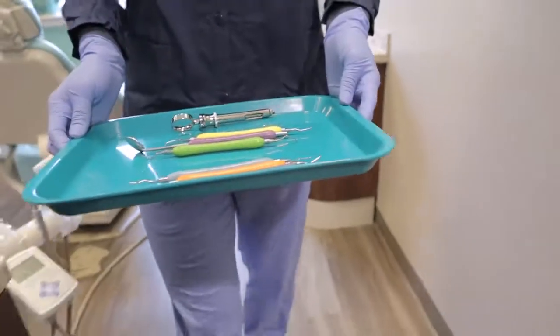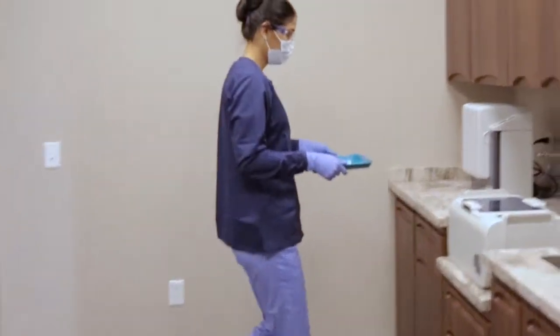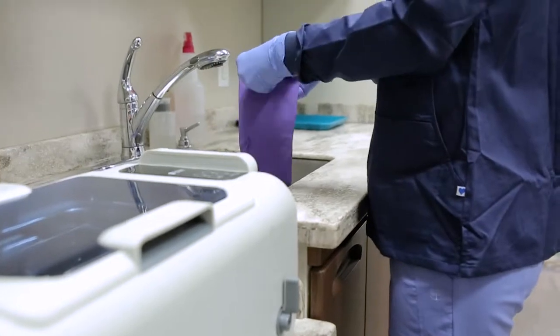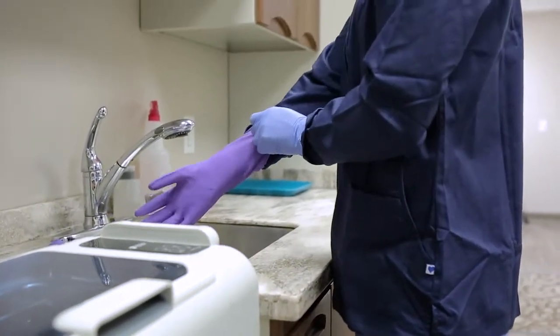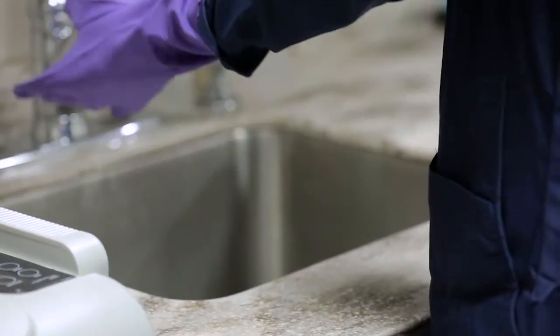Properly following the steps of instrument reprocessing is critical to prevent sterilization process failures and possible cross-contamination between patients. This video is an introduction to the operation of the 0.8 gallon and 2 gallon units.